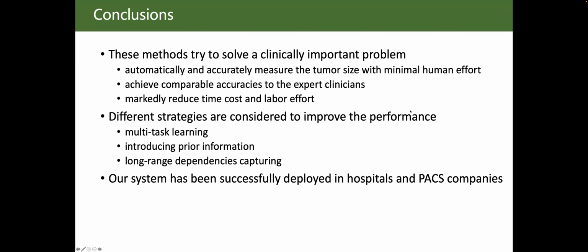And the second part is we try to use different strategies to improve the performance. For example, using multitask learning, introducing or better using the prior information. Also using a transformer to capture the long range dependence of the high resolution features.